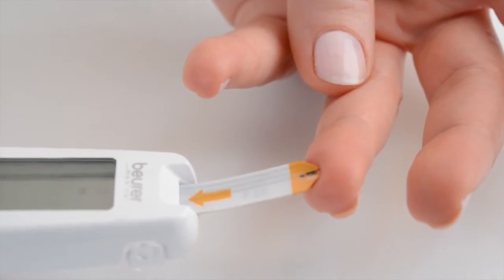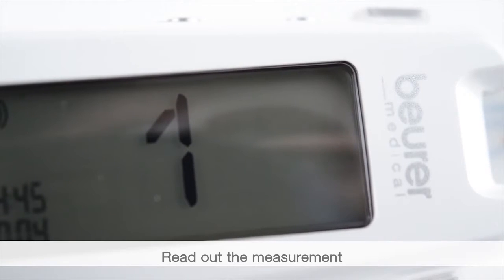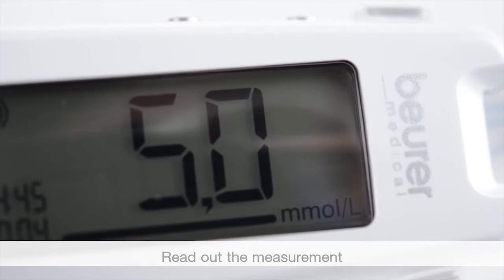The device begins counting down. The measurement can be read out and labelled. You cannot label it later.